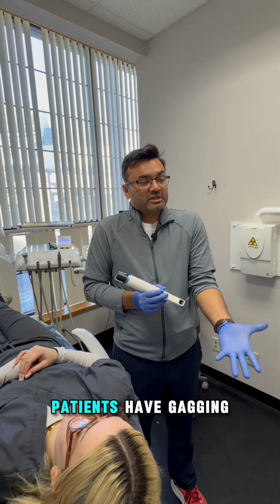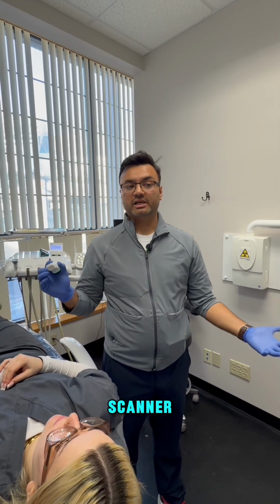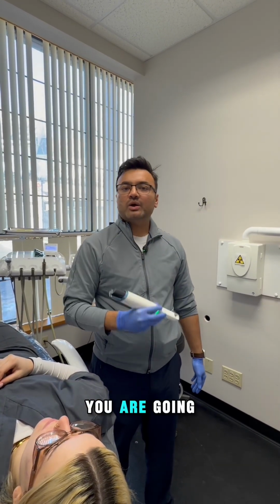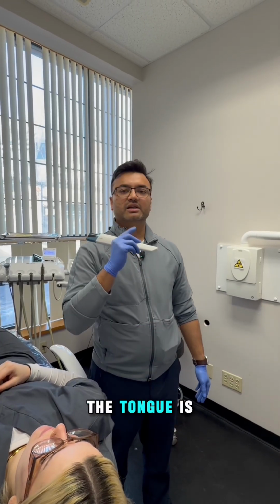All these things add up into image count, they add up into time. Also remember, a lot of patients have gagging issues. While the digital scanner is a tremendously helpful tool so that patients don't gag, the more time you spend, you are going to activate that gag reflex. The tongue is hypermobile.